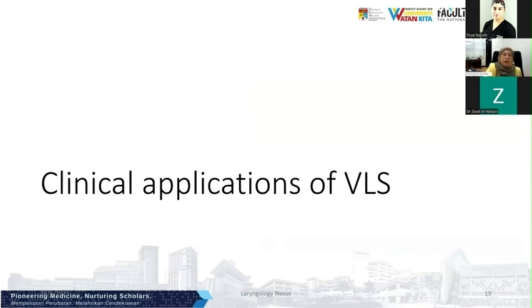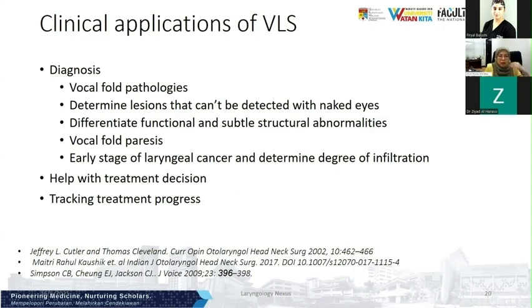Now we move on to the next subject. For you to be good at assessing the mucosal wave, you have to keep on thinking systematically. What do you look at? The moment you see it, is it symmetrical? What is the amplitude? Is there any non-vibrating segment? What is the phase closure? If you keep on doing that, you'll be better and better. And Ziad can share the experience that I told him from the start. You have to keep on doing this, so it becomes second nature to you.